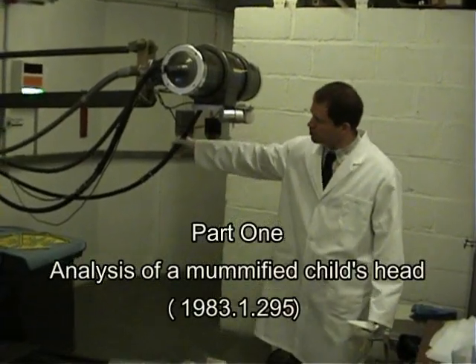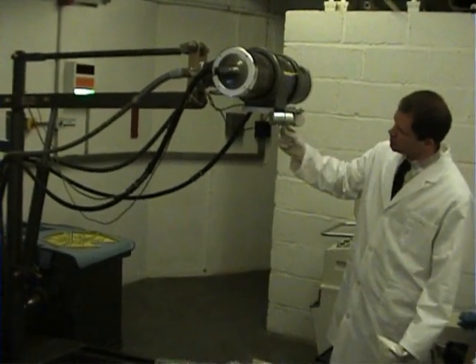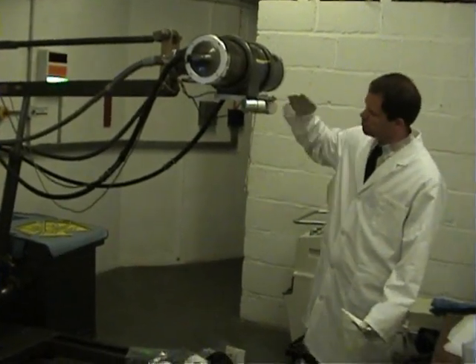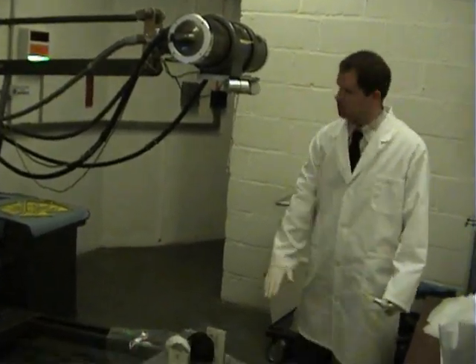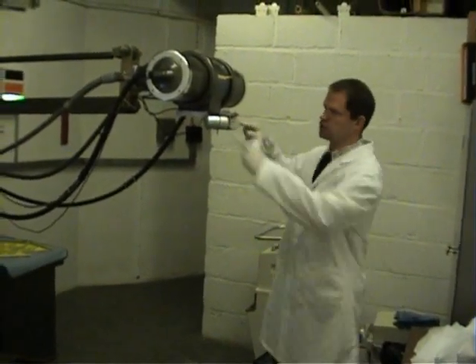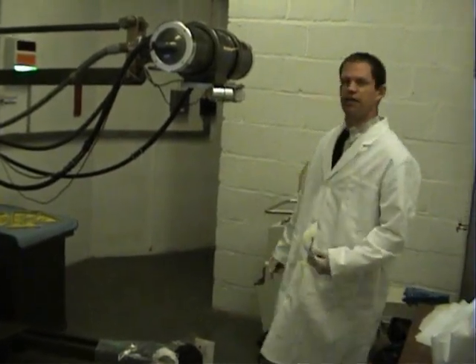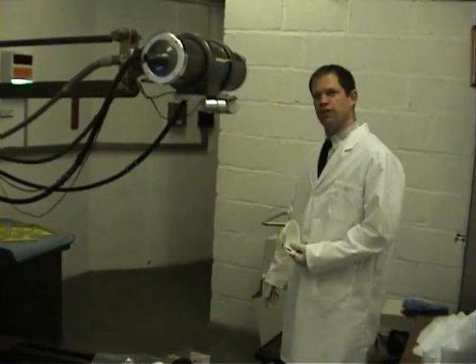The X-ray tube is supplied with cooling oil and high voltage cables. This is just a simple tape measure to measure the distance between the head and the sample. These two produce a cross of light which enables us to position the sample directly underneath the source of X-rays.